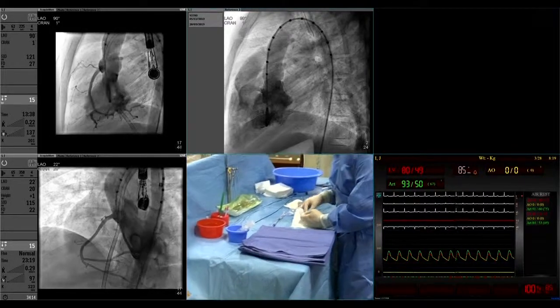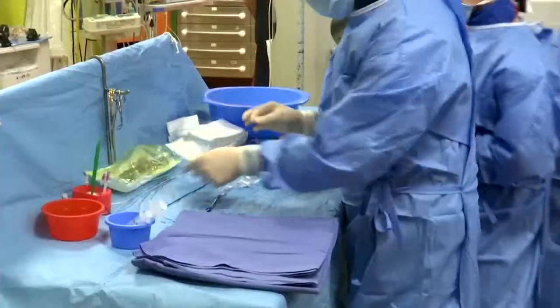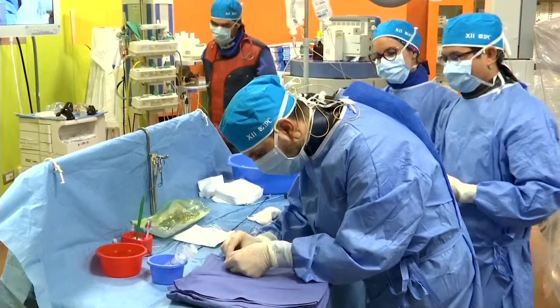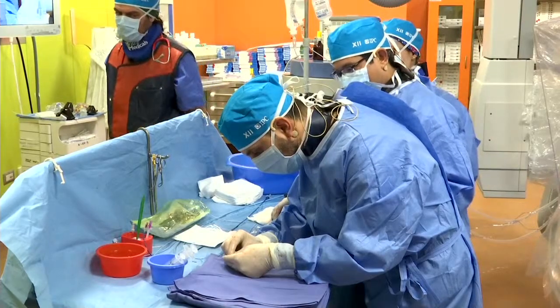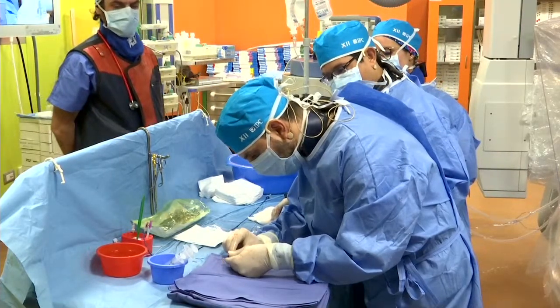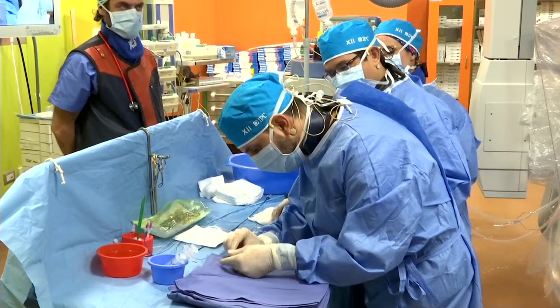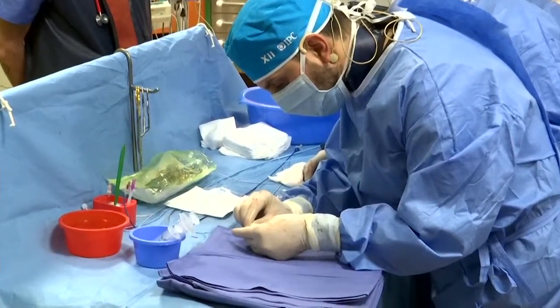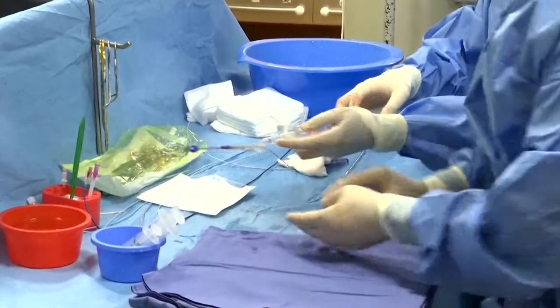Carlos, Dr. Joe raised the point of avoiding a disc to protrude into the right ventricular inflow region. So what advantage do you see by using a symmetric membranous LifeTech VSD device over a simple ADO1 device which will not have any retention skirt? Well, I mean, it's just more comfortable to have another disc on the right side.